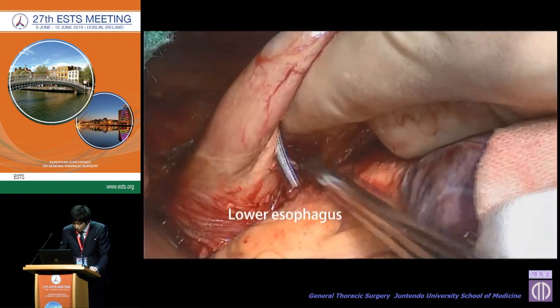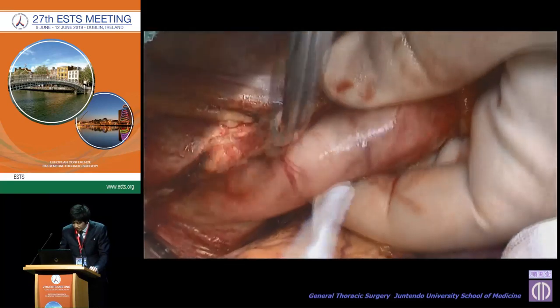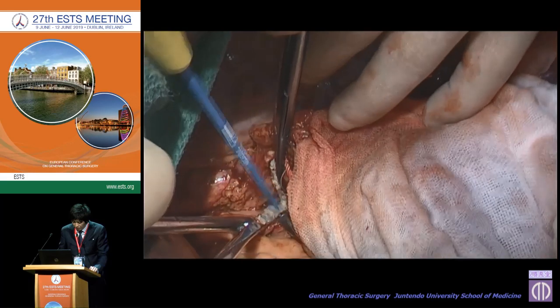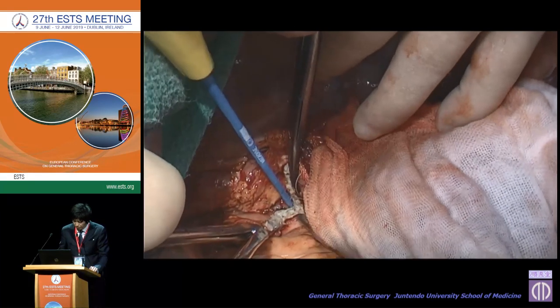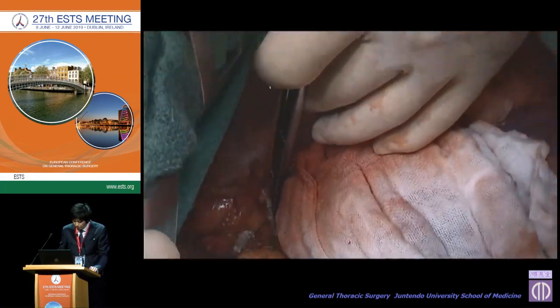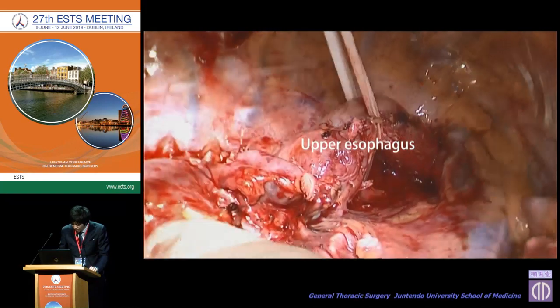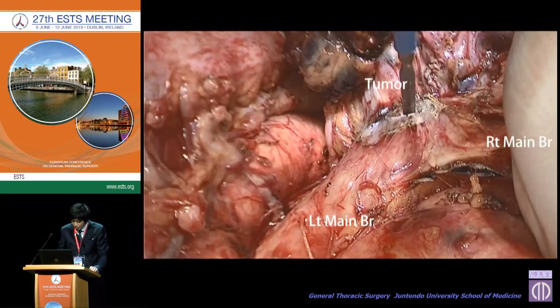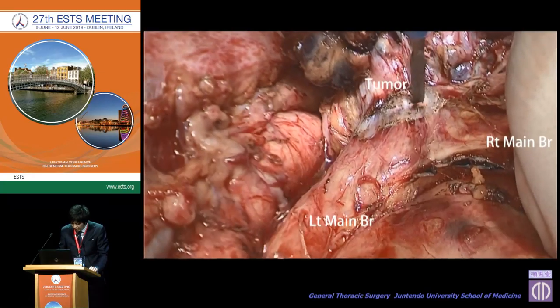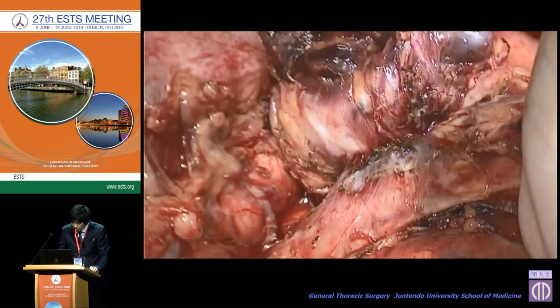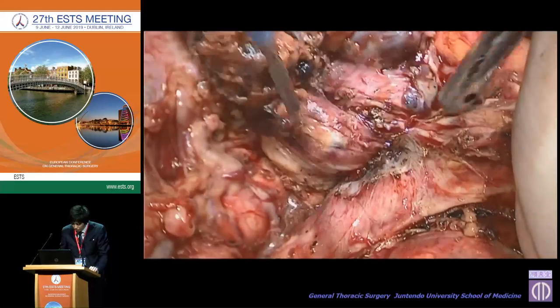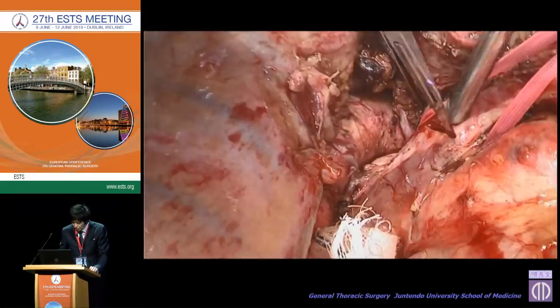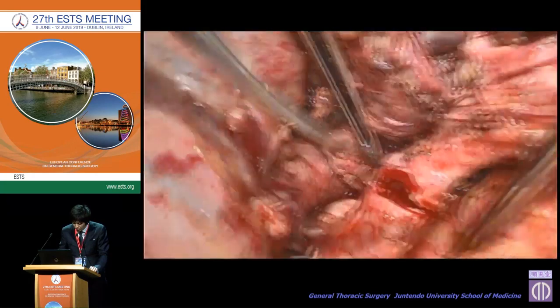Now I will show the intraoperative movies. At the beginning, we insert and tape the lower esophagus, then cut it. Then we insert the upper esophagus and cut it. The main tumor was found to have invaded the carina to the left main bronchus, so we proceeded to carinal resection. After taping the left main bronchus, we cut the left main bronchus.